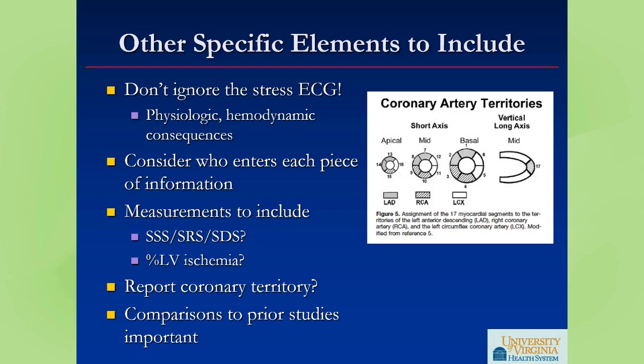One being if you actually have a recent catheterization, and so you know what defects the patient has, and you're assigning ischemic territories to those known defects. Potentially, you could even do this if somebody had had a catheterization previously, and you at least knew whether they had a large OM that tended to cover a certain area, for instance. But the only other time I will do it is when someone has a very classic LAD distribution. Then I'll tend to call that.